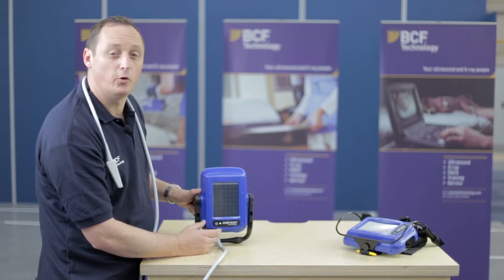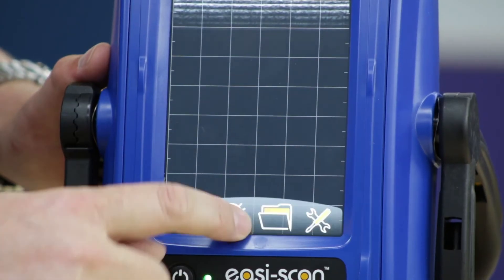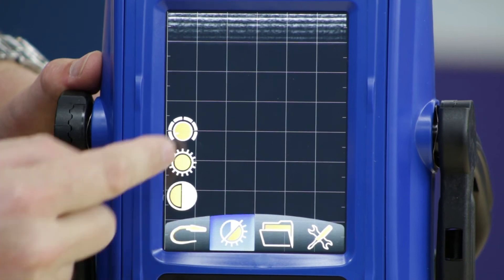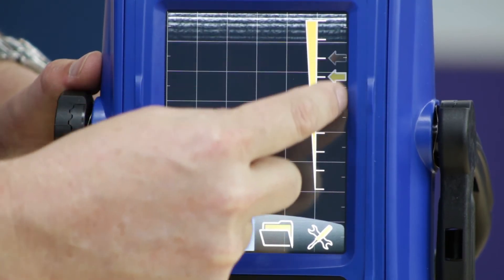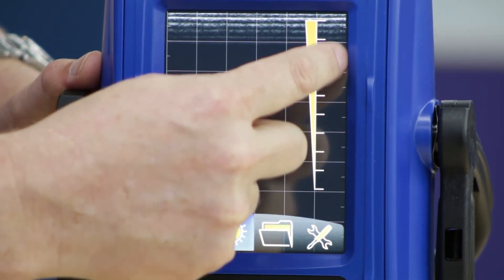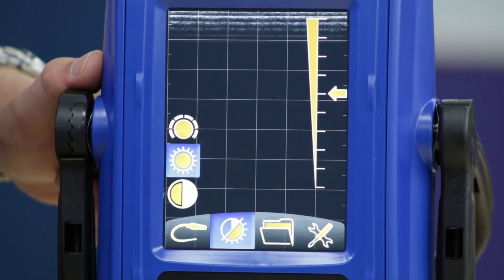If you'd like to adjust how your image looks, we have that capability on the smart display. Touch the touch screen and select your viewing option. The first one is contrast — you can adjust how the image looks. You can then select brightness and adjust it, so you have full control of your image.